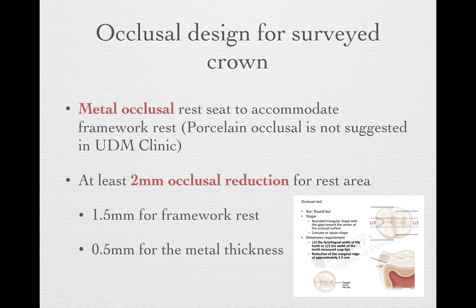And the problem is that after you get those occlusal reductions, the pulp is easier to expose and the patient may more easily feel sensitivity. That's also the other reason that we will more likely use a metal occlusal rest seat design in the dental clinic.